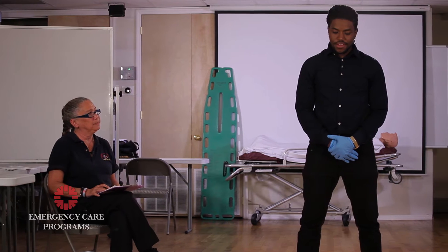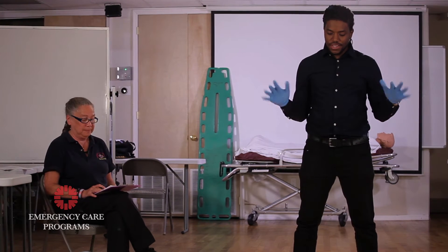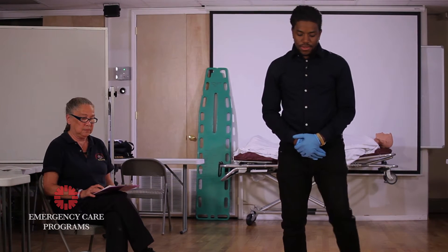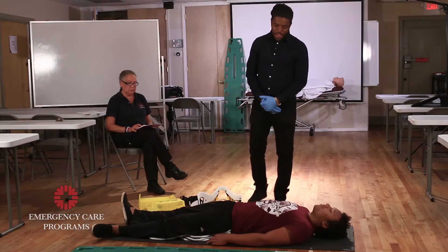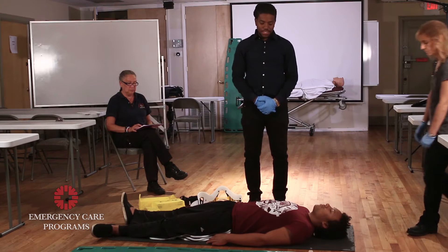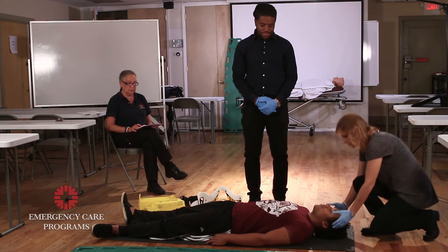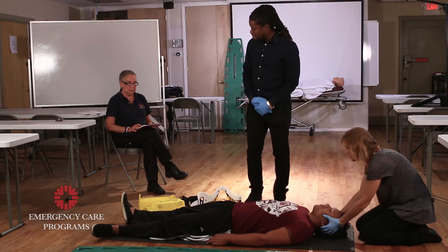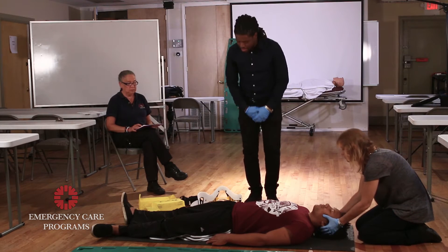No, I do not. Okay, whenever you're ready. All right — BSI, the scene is safe. I'm going to come on scene. I'm going to have my partner Karen maintain C-spine stabilization. At this moment, I'm going to measure and apply a cervical collar.